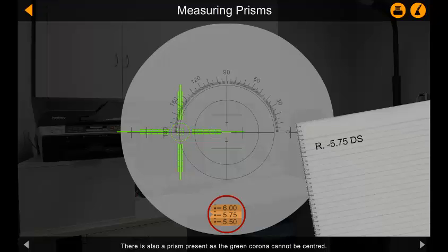There is also a prism present as the green corona cannot be centered. The prism is measured by the amount of displacement it causes. Each marking on the reticule represents one prism diopter. In this case, the prism for the right eye lens is displaced by three prism diopters.